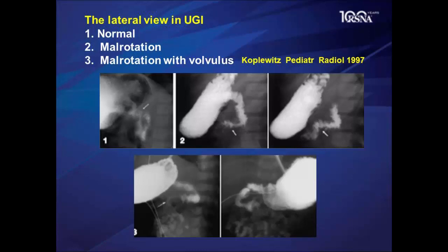That's the beginning of the corkscrew. We turn the patient to AP projection, and that's the circle here, the whirlpool. So it is very important to follow the duodenum opacification with the patient on his side, to follow the behavior of the duodenum, and then turn the patient AP to document the location of the duodenojejunal junction, if there is opacification. Otherwise, you will see that corkscrew sign.